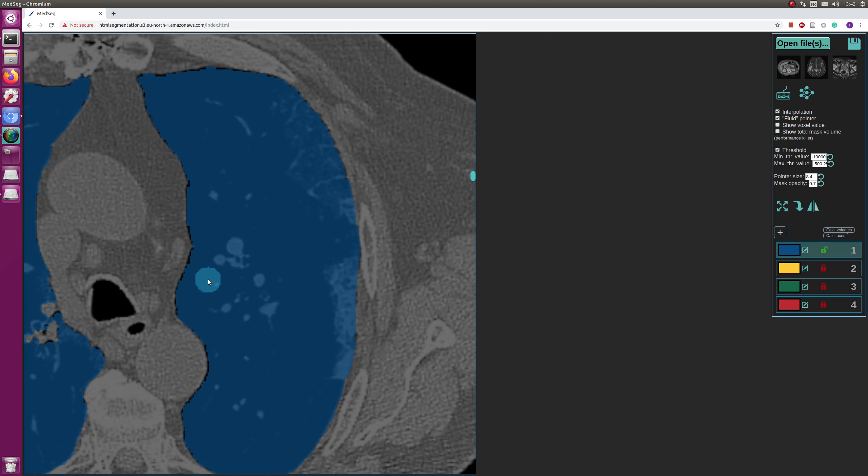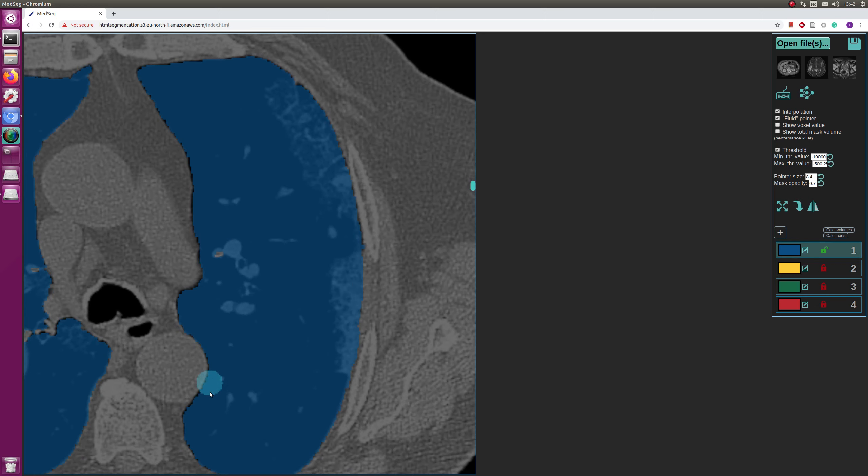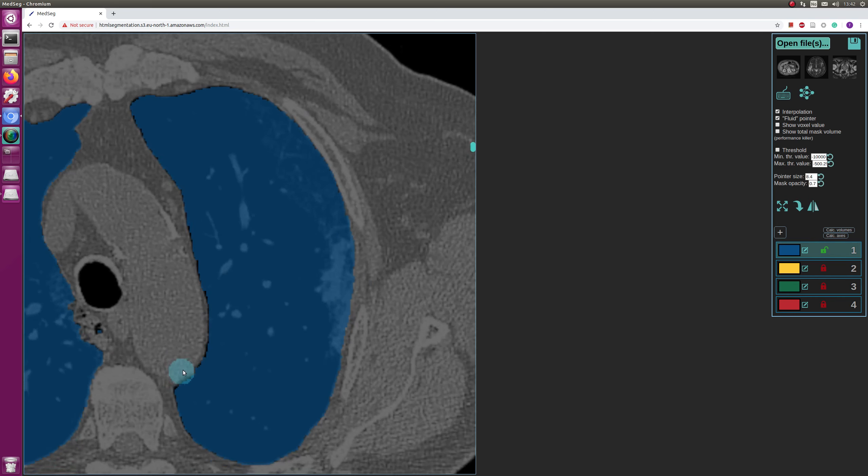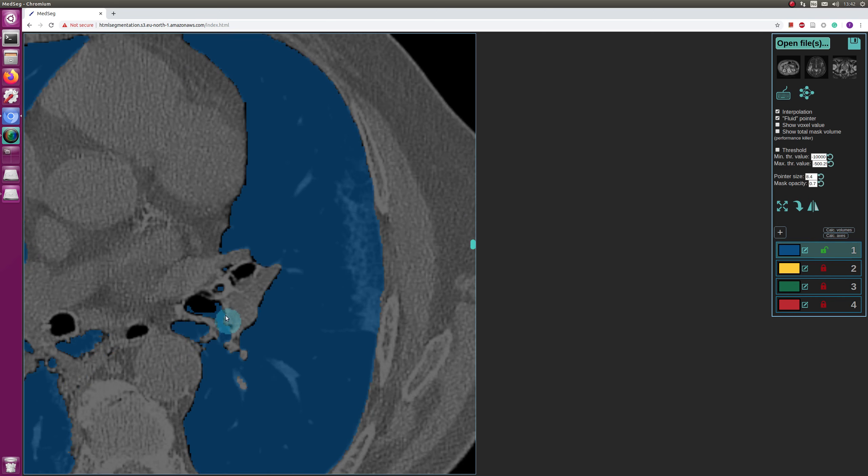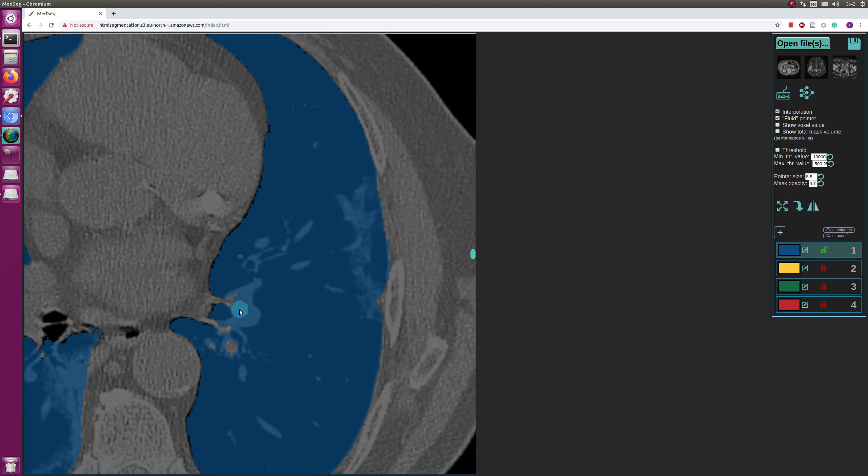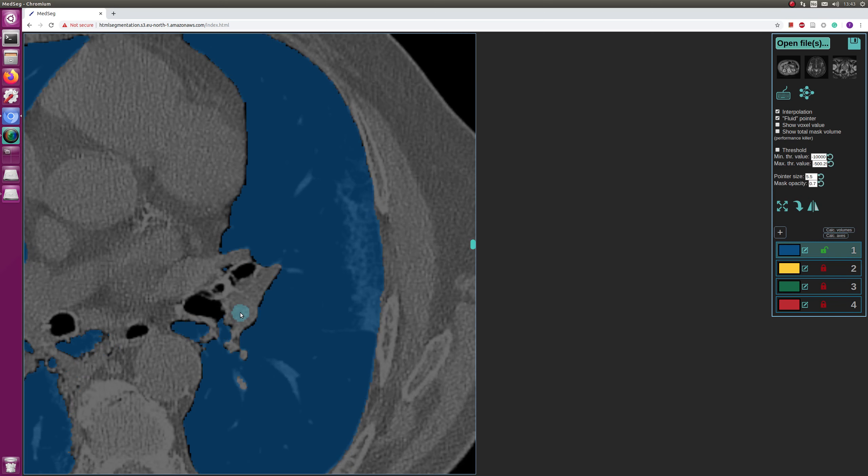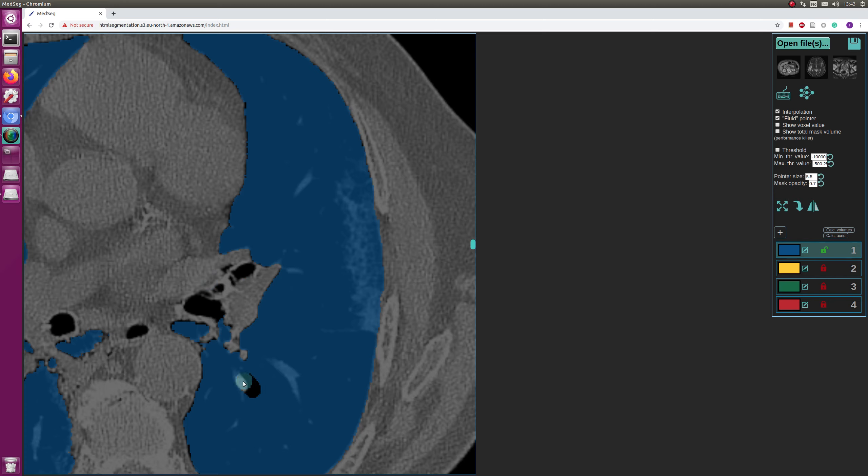It's always the question of how many perihilar structures do you want to include, like how much of the central bronchi should you exclude from the lung segmentation. And I really don't have a good answer for that, but I try to exclude at least the central structures like this.